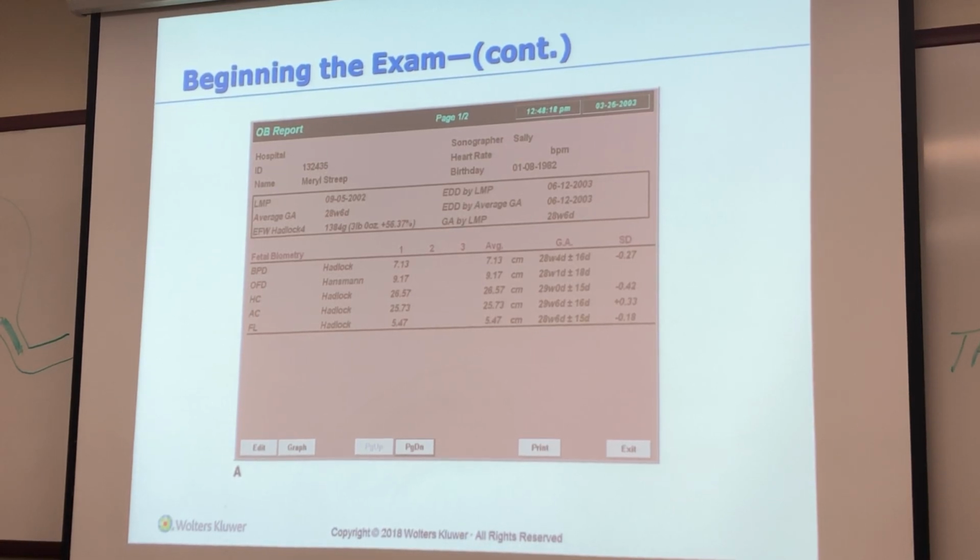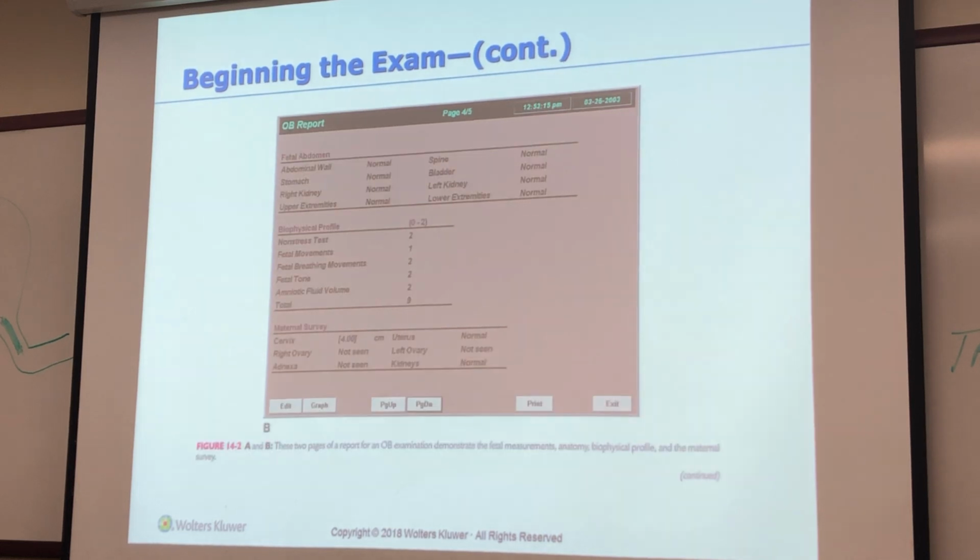Because if my cephalic index is off, then my BPD will be below if it's dolicho. It'll be above if it's brachy. Okay? And is cephalic index on here? I don't even see it on there. Is it on this next one? No, it's not on that one either. But it'll have the cephalic index on there.